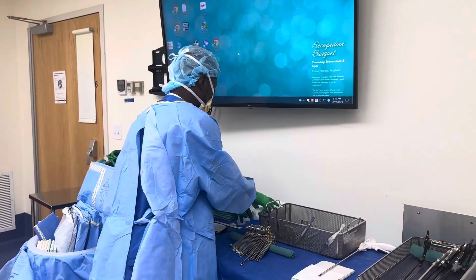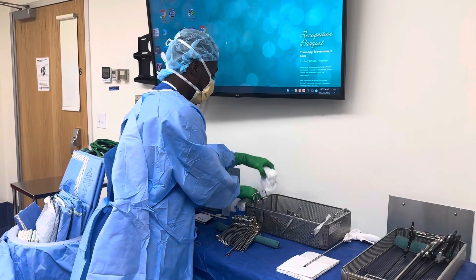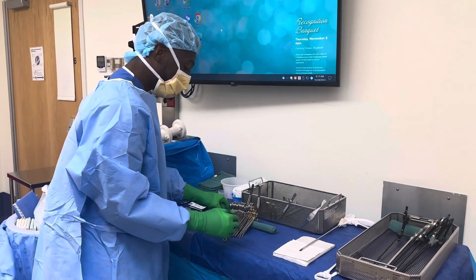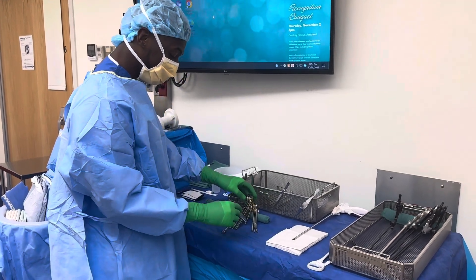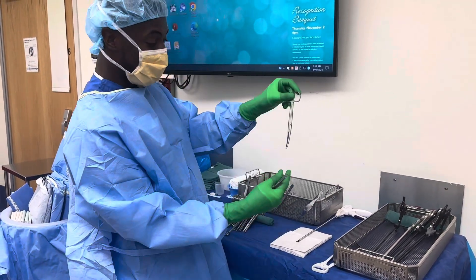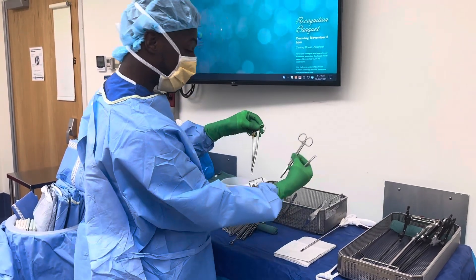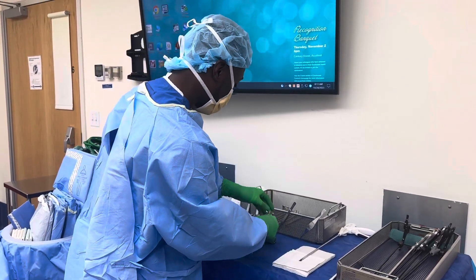We got some lap sponges, some Raytec. Here's our stringer — I'll show you that real quick. On our stringer we have three scissors: we have a curved Mayo, a Metzenbaum, and a straight Mayo, a couple of needle drivers.